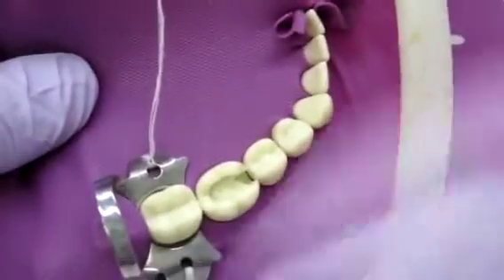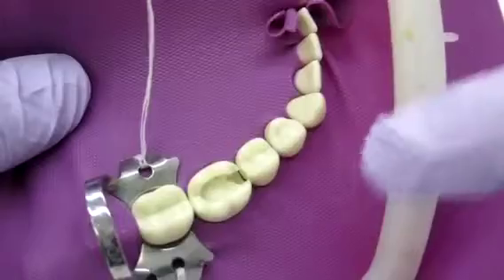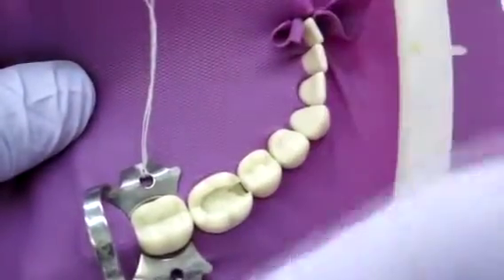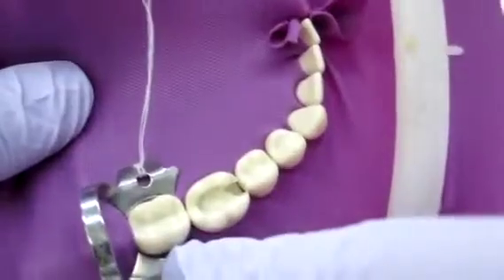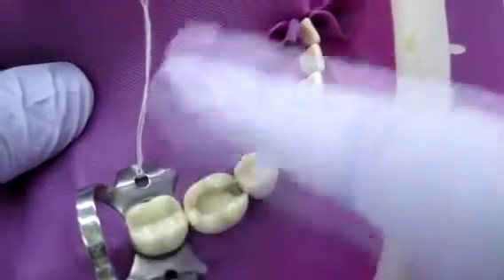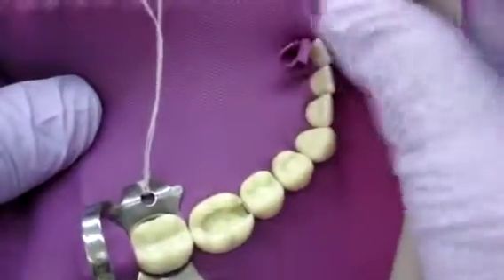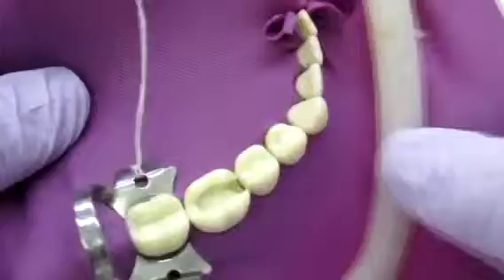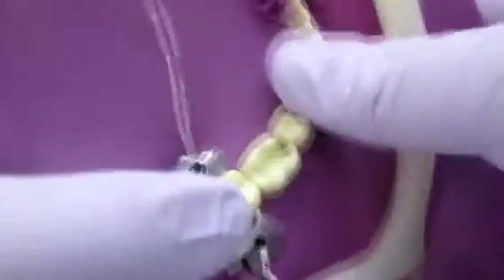So the first thing you do is put on the rubber dam, and we're doing quadrant isolation — so it's one tooth past the midline. I've been putting the clamp on 31 so I still have access and the band can go over 30. I like it with floss and I stop it from popping out with a little piece of rubber dam. Put the frame on and let's get started.